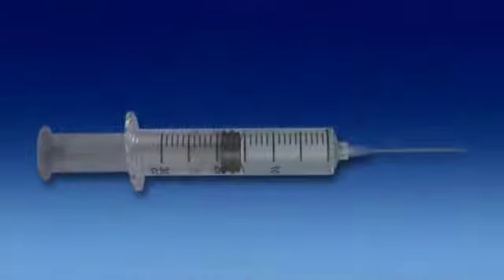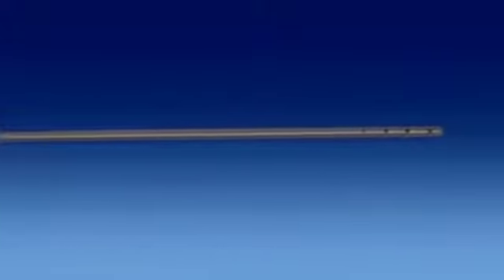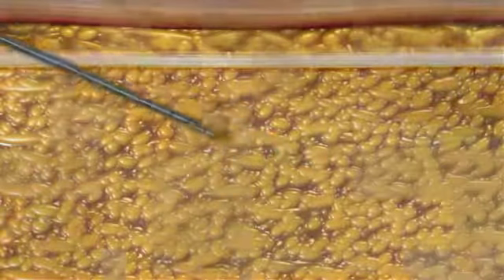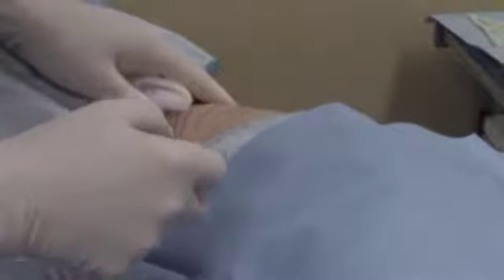Fill a 20 milliliter syringe with tumescent anaesthetic fluid and attach the multiport infiltrator cannula. Insert the cannula through the skin puncture site, entering the subdermal fat layer. The cannula should perforate and remain below Scarpa's fascia in the abdomen. Pass the infiltrator cannula in a horizontal manner within the fat deposit, creating a spokes-on-the-wheel pattern. Slowly inject tumescent fluid during both entry and withdrawal strokes.